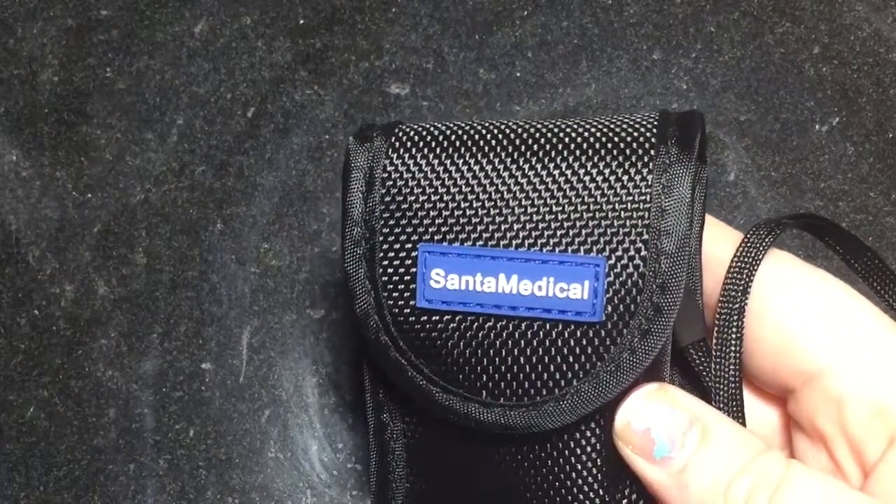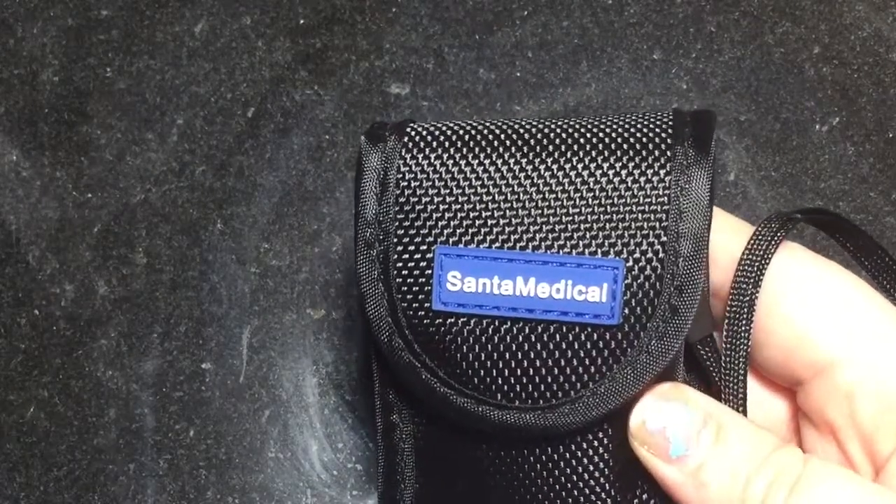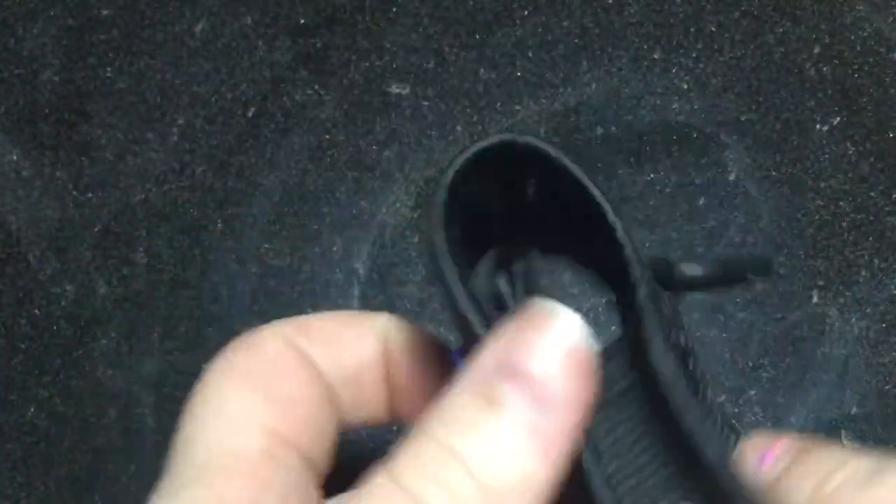Hey guys, I just wanted to do a quick video about the Santa Medical pulse oximeter. It comes in this cool velcro carrying case that also has a loop where you could attach a keychain to it, and it also has this long carrying strap.